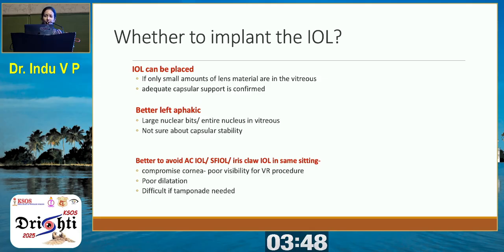Secondly, sometimes during vitrectomy, if you find that there is a retinal problem, you will have to put tamponade. Tamponade is usually silicone oil in most of these cases. So if the IOL is unstable, silicone oil starts leaking anteriorly into the AC.